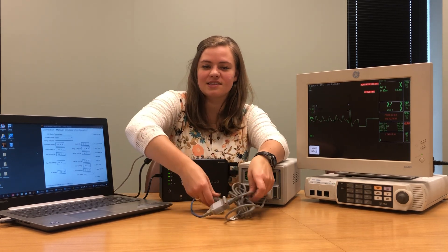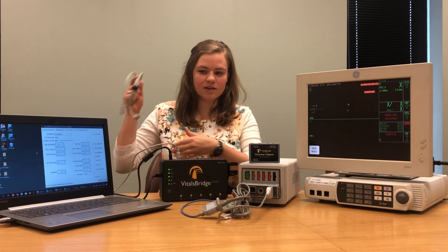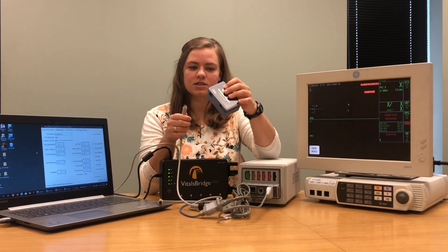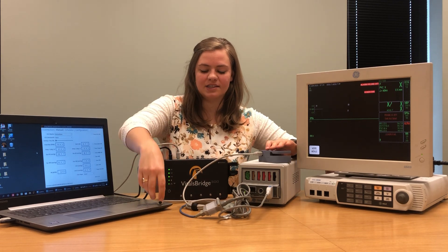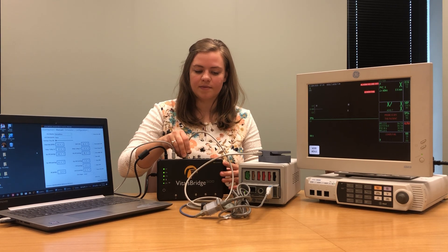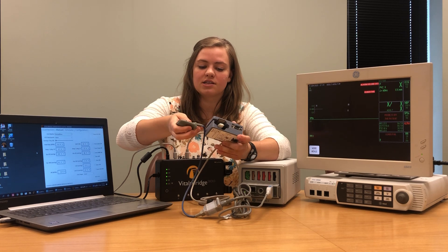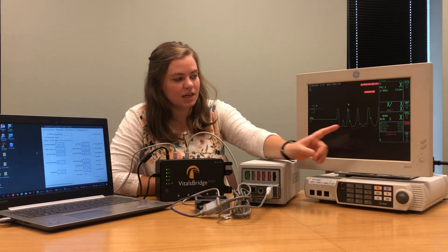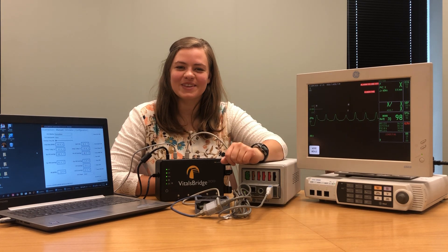We know that everything is working well there, so we're going to set this aside and pull out the oximeter adapter which came included with our VitalsBridge. It should have included a gray box as well as a cable that has two matching ends. Plug one end of this cable into the oximeter adapter box where it says SPO2 port VitalsBridge. Once you have that plugged in, plug the other end into where it says SPO2 on your VitalsBridge. Then take the finger probe you've already verified works and slide it onto the white finger of the SPO2 oximeter adapter. Once it's in place you should begin to see an SPO2 waveform, heart rate, and saturation level.